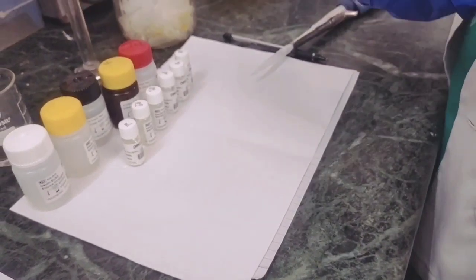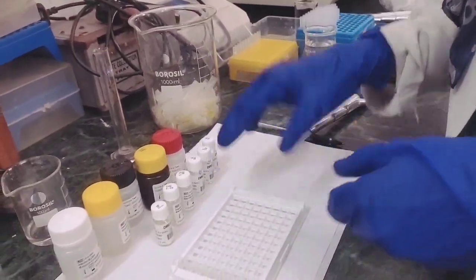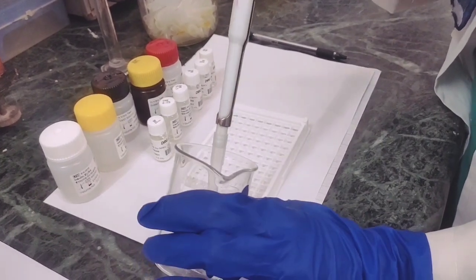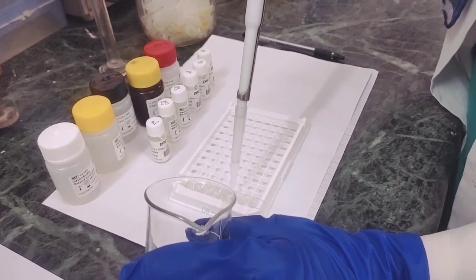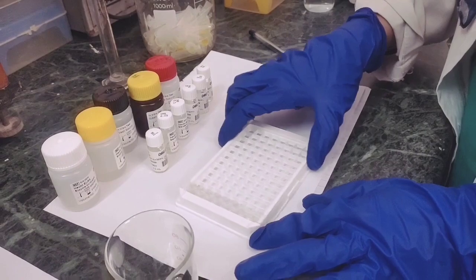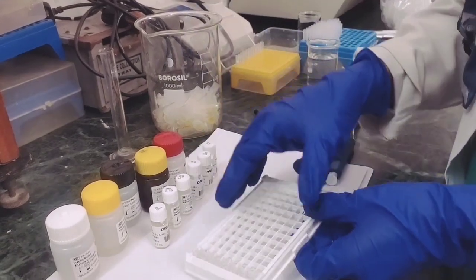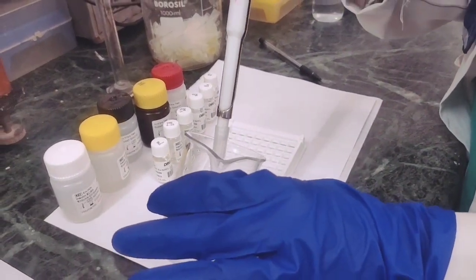This is the first time. Discard the wash buffer. And discard the wash buffer. And the final third wash.